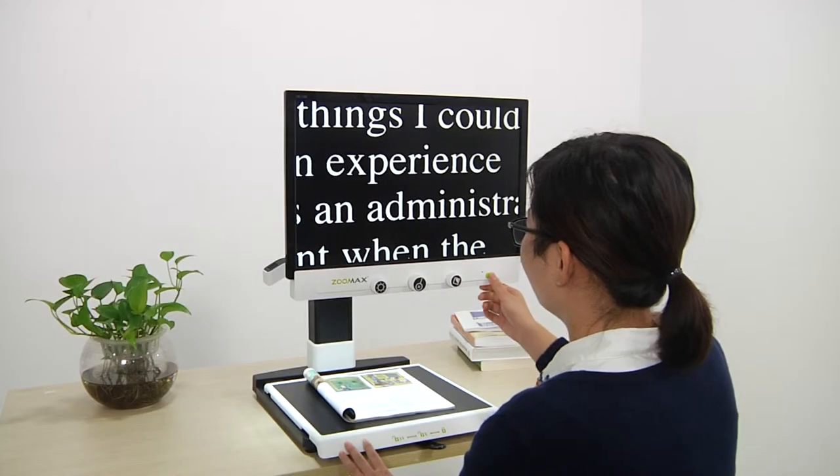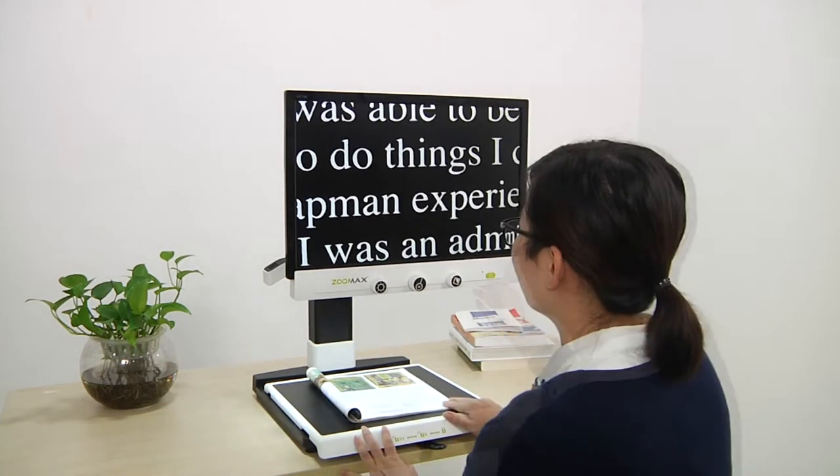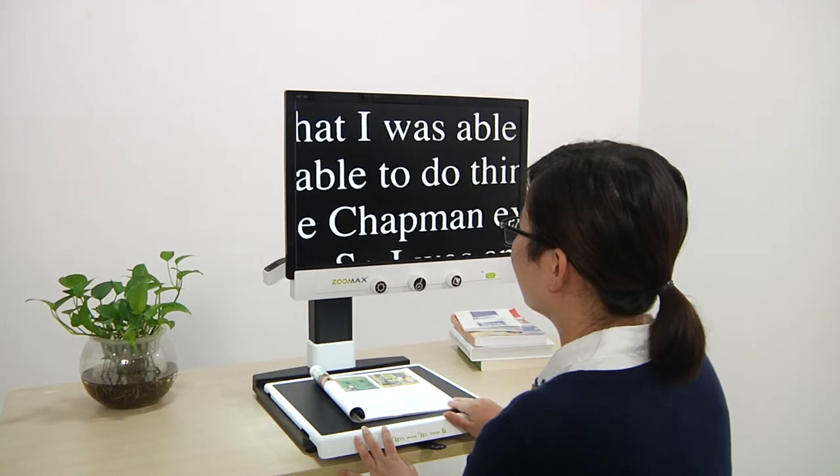All the last settings, including favorite magnification, color mode, and brightness, will be saved automatically for your next use.